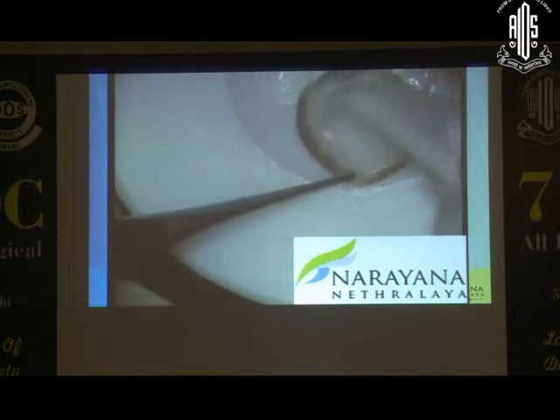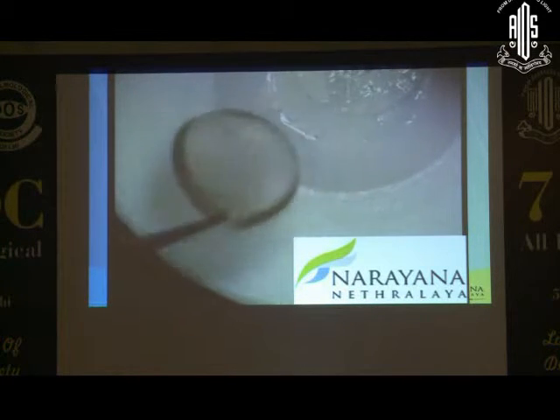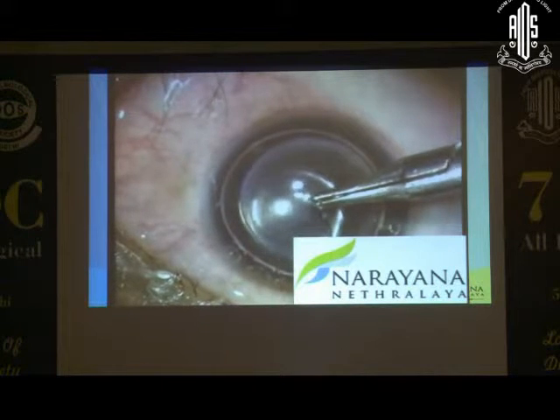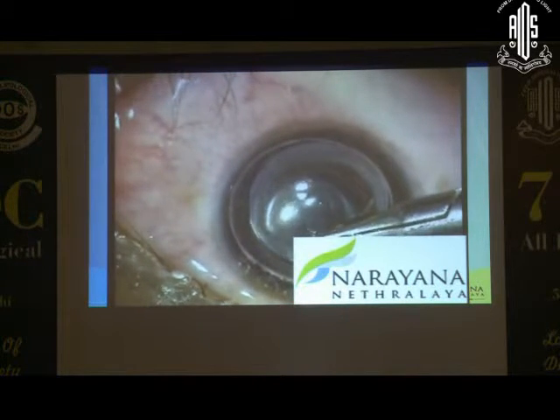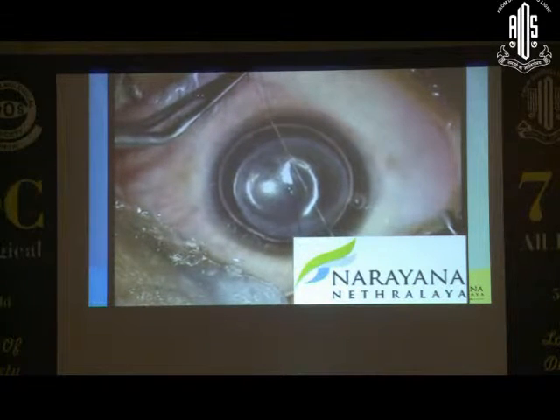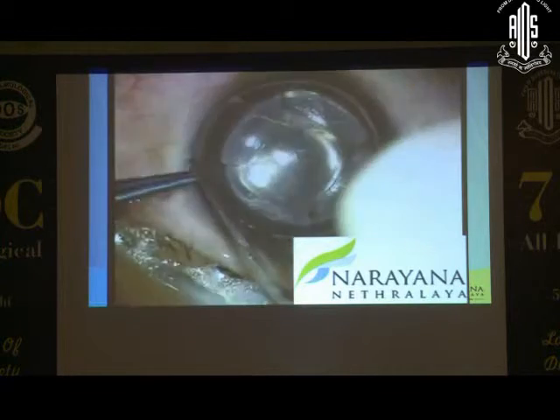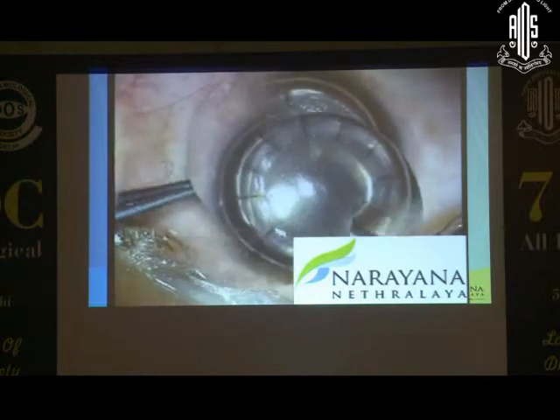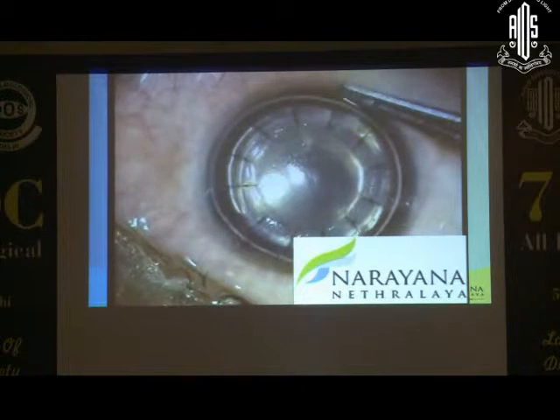Now we remove the donor endothelium from the stroma, and then this is sutured onto the host bed. Perforation can even occur at this point of time if we are not careful and if we pass the sutures full thickness. So care should be taken to suture the partial thickness of the stroma. End result would appear somewhat like this.